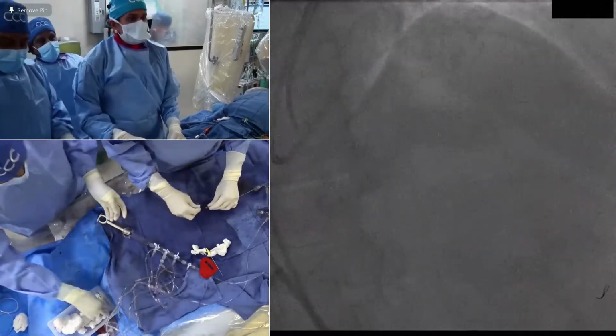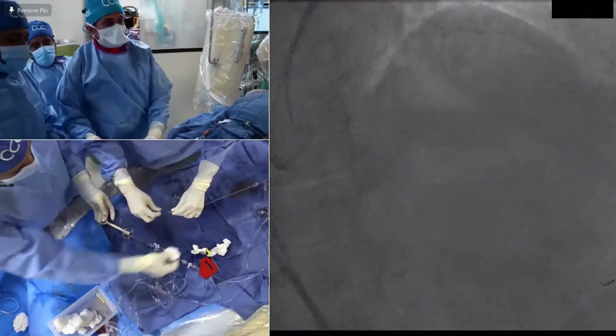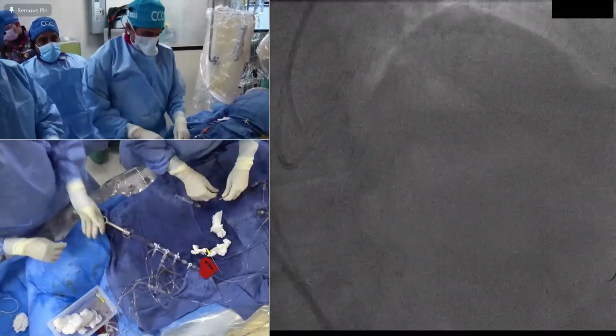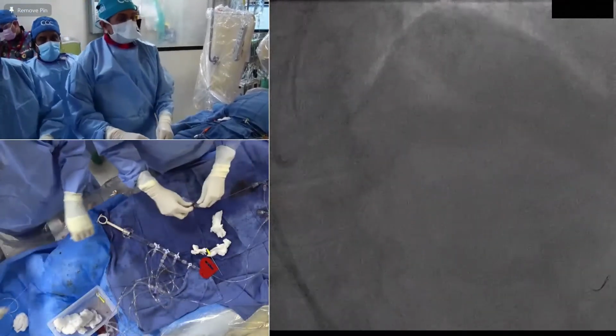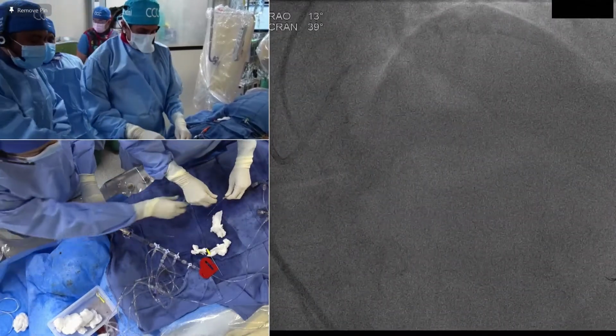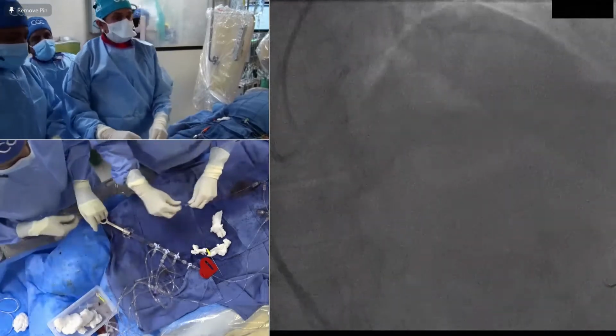See that? Your nose, just to teach everybody, once you brought the nose of the catheter into the lesion, you can leave it there, take the wire out and put your Rota wire in, and it will go almost every time. Maybe 1 in 1,000 would not, but otherwise it will go in every case.